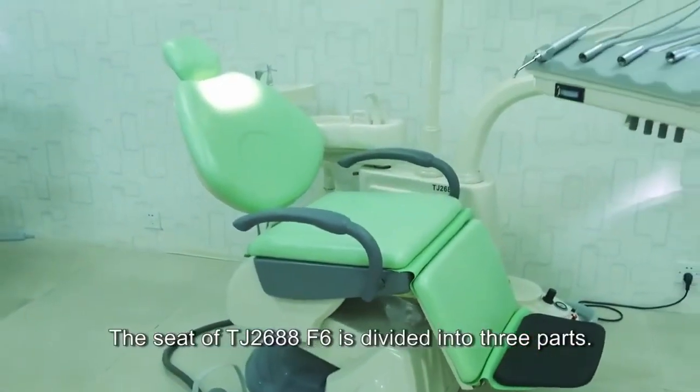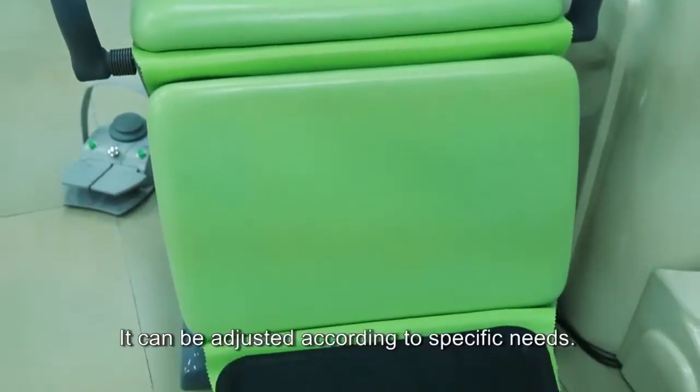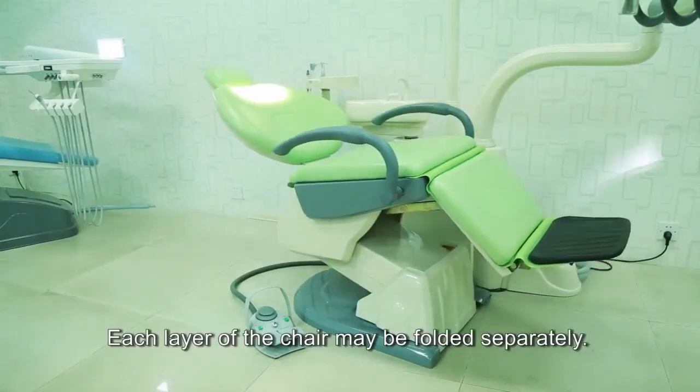The seat of TJ 2688 F6 is divided into three parts. It can be adjusted according to specific needs. Each layer of the chair may be folded separately.